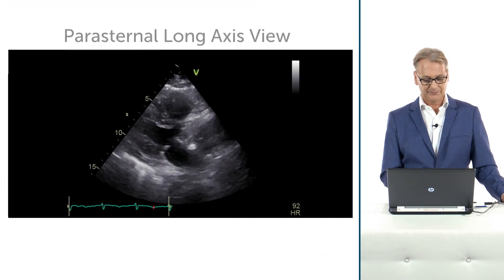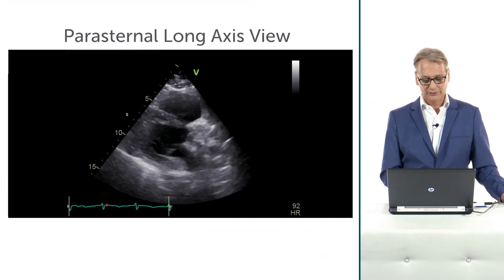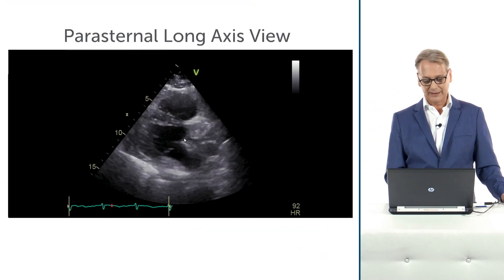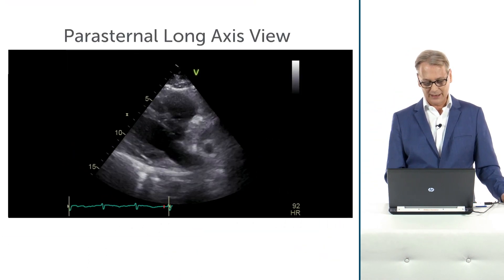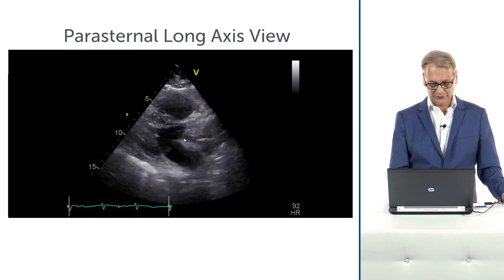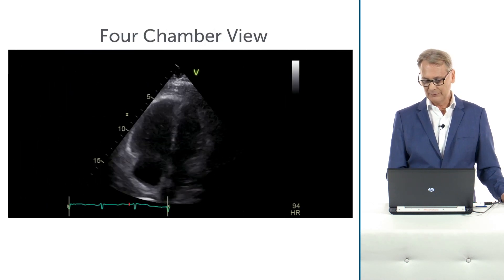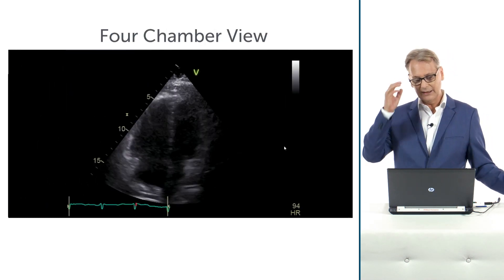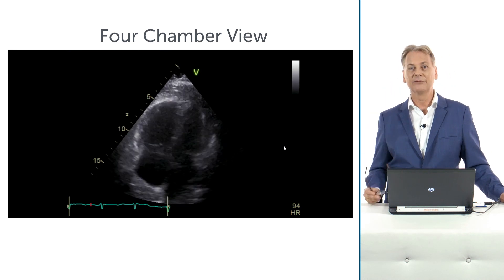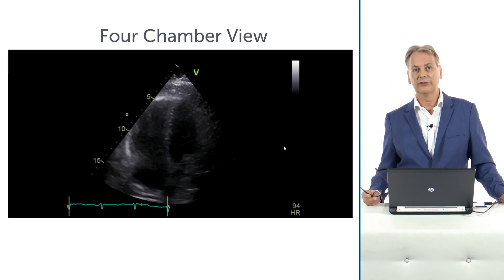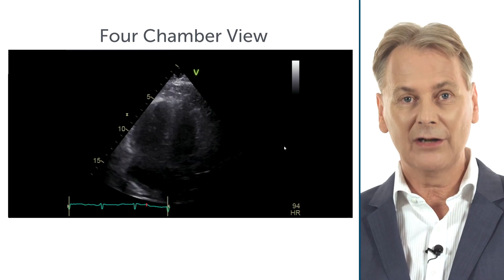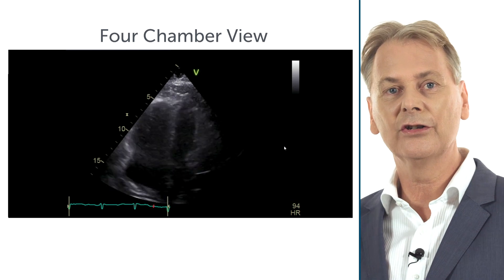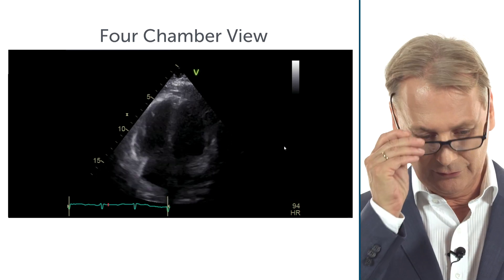Here is the echocardiogram. You might not appreciate the problem in the parasternal long axis view, but in the four-chamber view it's clearly a dilated right ventricle. It's a rather large right ventricle, much larger than the left ventricle.